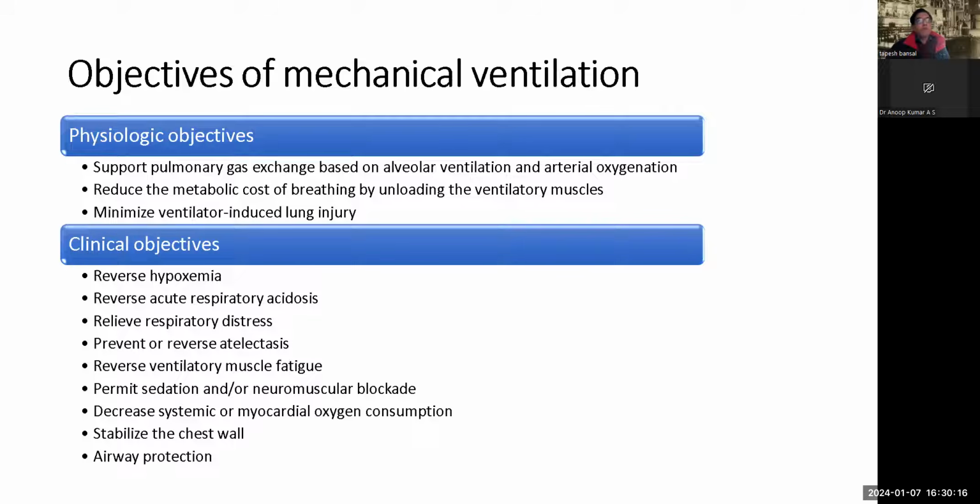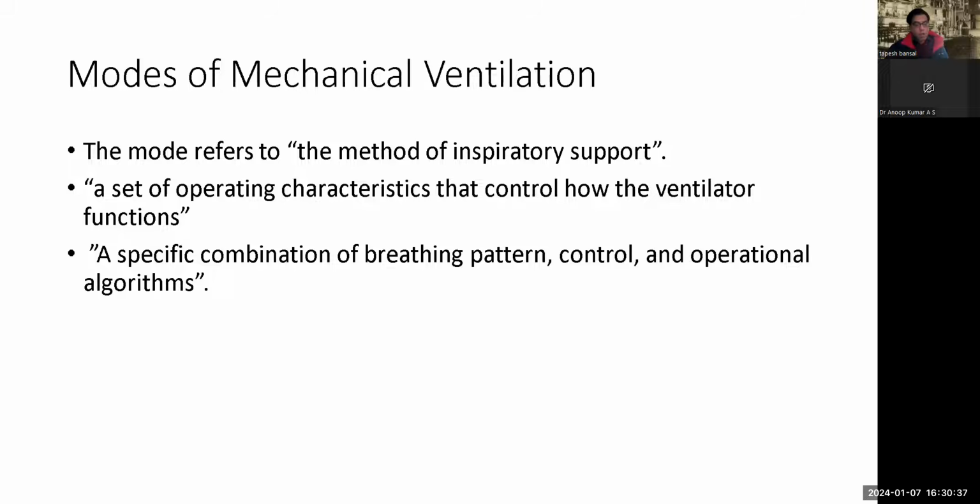In some particular situations, decrease systemic or myocardial oxygen consumption in a severe septic shock patient, and stabilize the chest wall, maybe in a patient with a flail chest, etc. And airway protection, as I've already told during the initial slide, when the patient is having decreased sensorium.